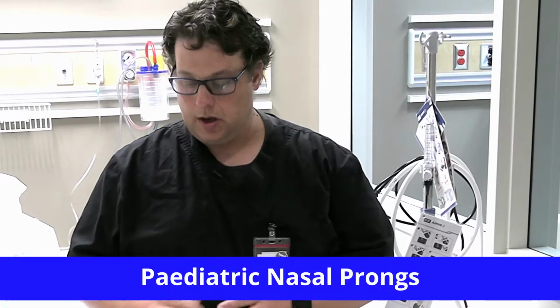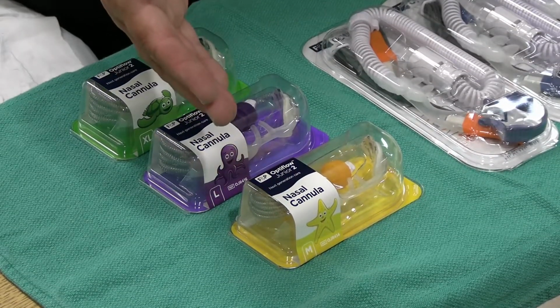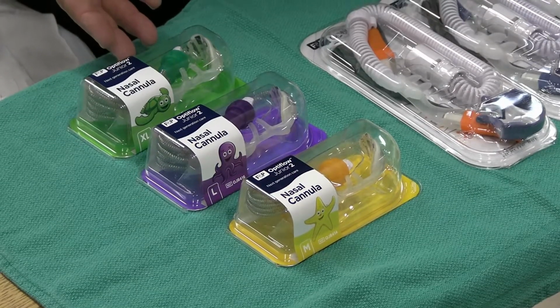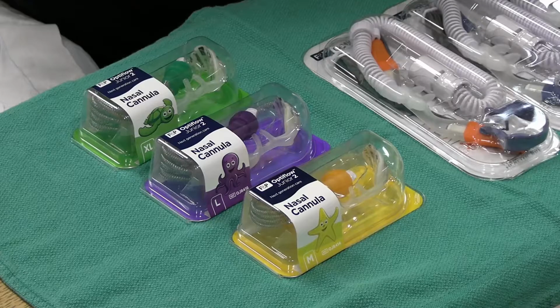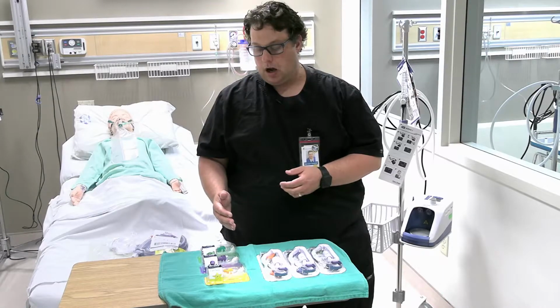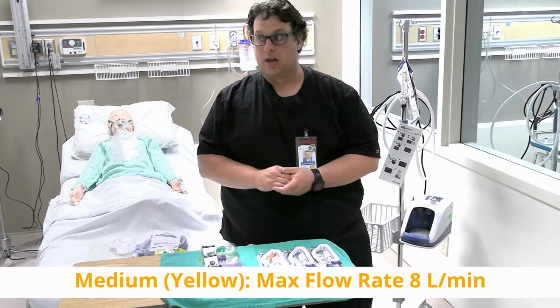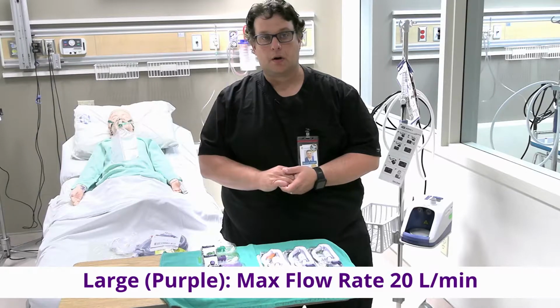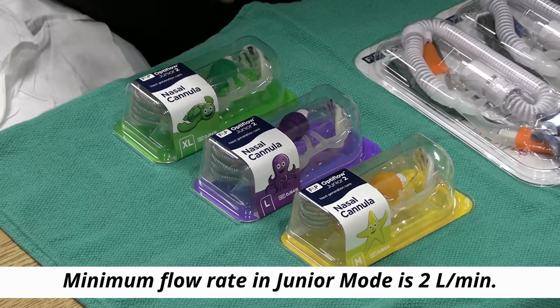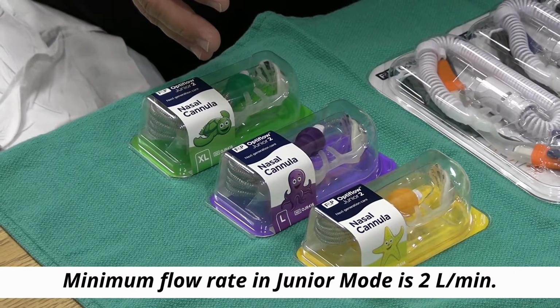So in the junior mode, you have 3 nasal prongs that are available to you, and you'll see that they are color coded here. We have our medium prongs, which are yellow, your large prongs, which are purple, and your extra large prongs, which are green, in order to deliver therapy to your patient. Now, depending on what size of prongs you pick, depending on the size of your patient, they are only able to deliver a specific liter flow. For example, the yellow nasal prongs can go only to a max of 8 liters per minute. The purple prongs are able to deliver 20 liters per minute, and your green prongs can go as high as 25 liters per minute. In addition to the max liter flows that these junior prongs are able to deliver, it's important to note that the minimum liter flow that they are able to deliver is 2 liters per minute.